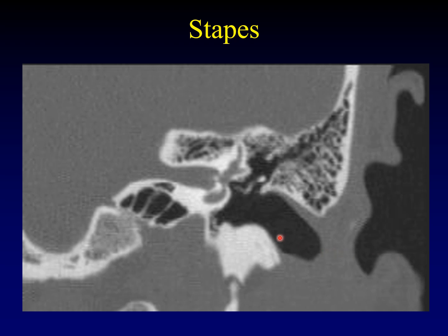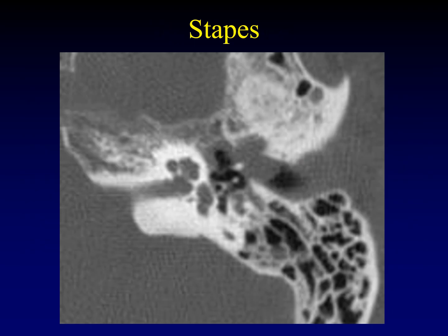The stapes is usually best seen in coronal projection, where you can follow the long process of the incus down through the incudostapedial joint to the stapes extending medially toward the oval window. On this image, it's also worth pointing out the tympanic segment of the facial nerve, which runs adjacent to the tympanic cavity. The facial nerve is only about one to two millimeters from the stapes, which is why a dehiscent facial nerve can affect the stapes. In the axial plane, you can make out the stapes neck and both anterior and posterior crura as it sits upon the oval window.